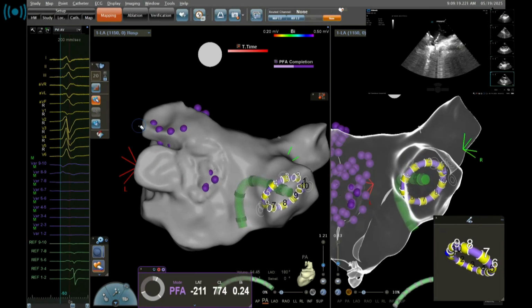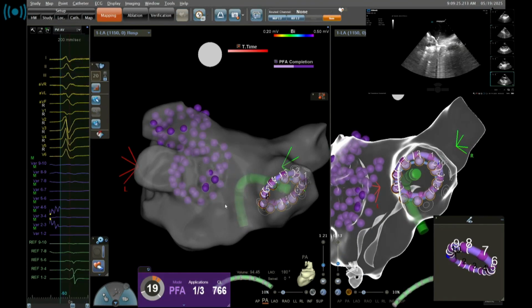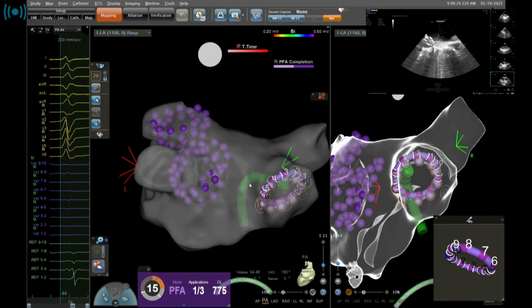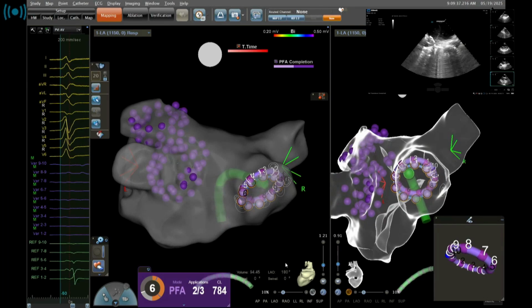If the vein is flat, sometimes it's difficult because you get a much stiffer device when you close the circle. And then you also have the problem of overlapping, so you have to switch off some of these electrodes during application so there's no clash. Is it easy to judge which ones to turn off?